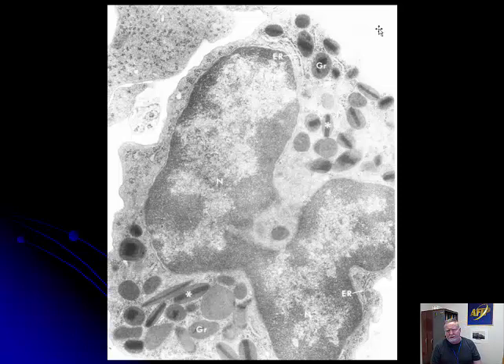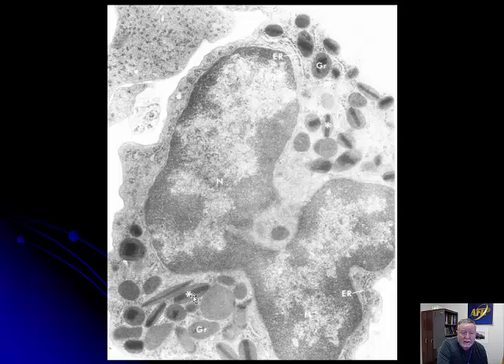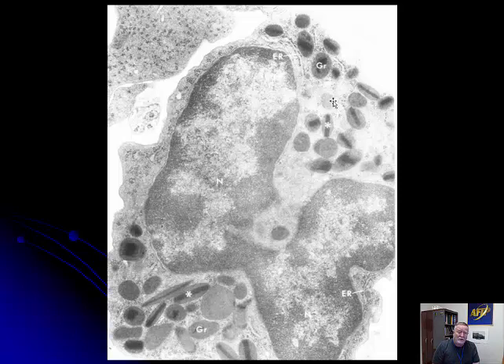Neutrophils and eosinophils could look alike on the right section — they both have a multi-lobated nucleus. But eosinophils have granules with a dense, often linear crystalloid, which is thought to be major basic protein. There's often a lot of histamine surrounding them. Major basic protein is a very caustic substance, which is why eosinophilic inflammation tends to cause a lot more damage than the corresponding amount of neutrophils. Eosinophils are often attacking parasites, which are tougher than your average bacterium.